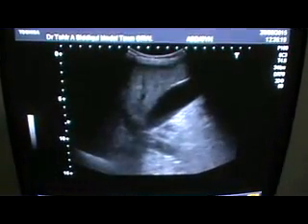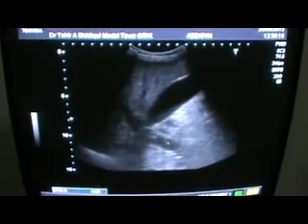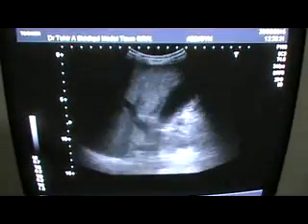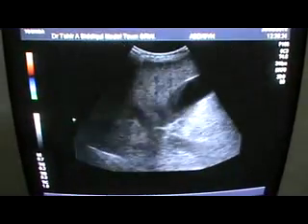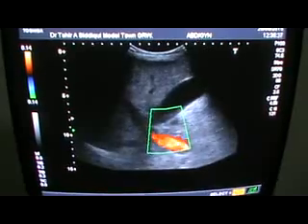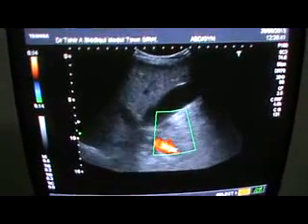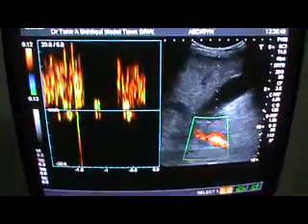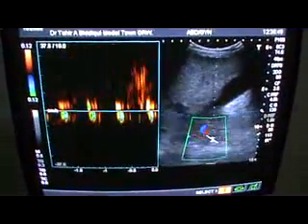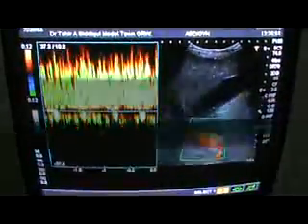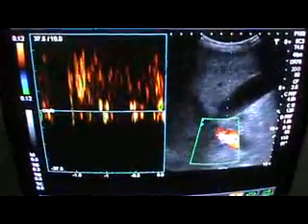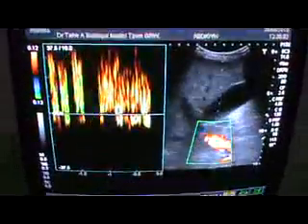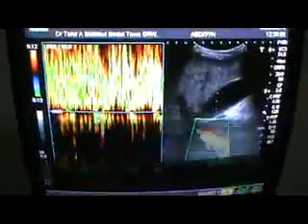What we see here is the gallbladder, the liver, and the portal vein. The portal vein is approximately 15 mm and is dilated. It shows normal flow direction. The flow velocity within the portal vein is significantly raised. Moreover, there is mixing of blood in the whole vein.